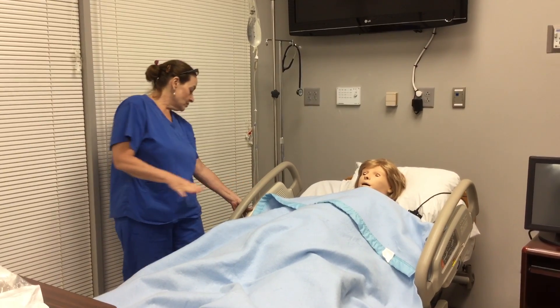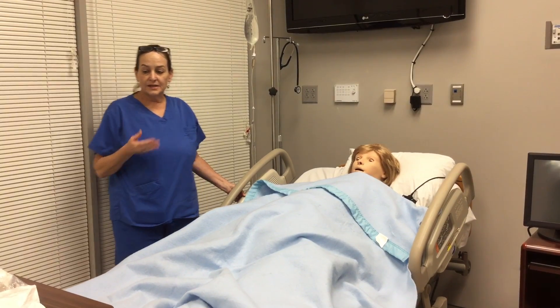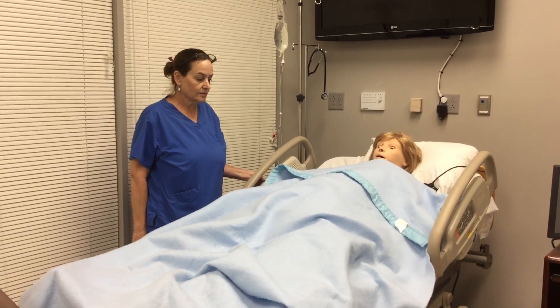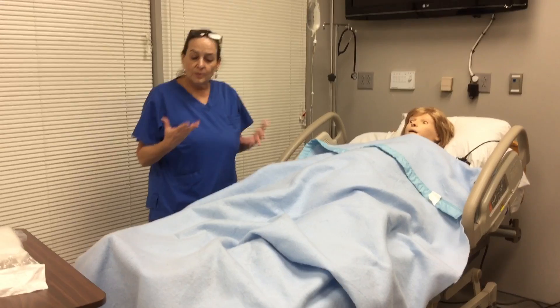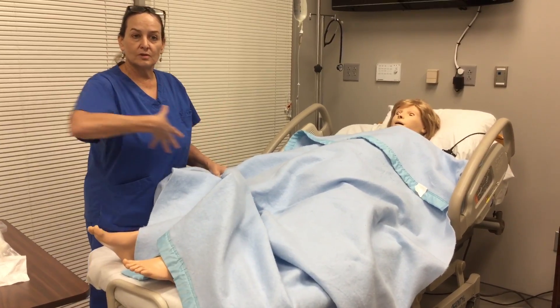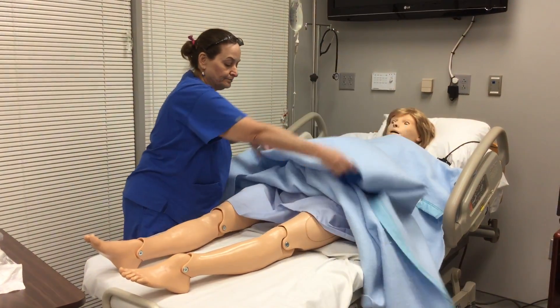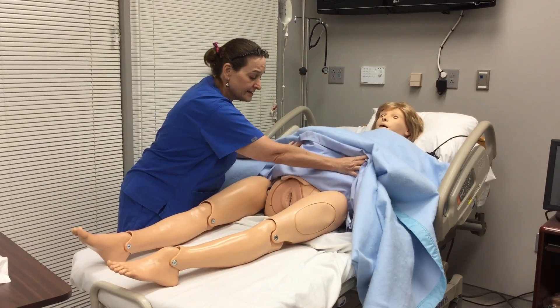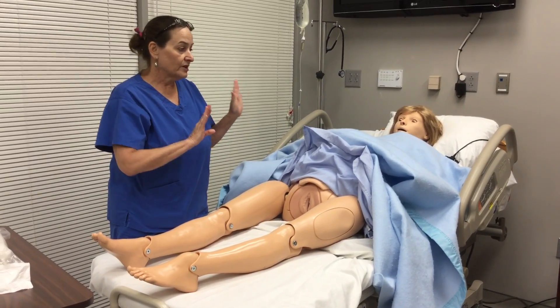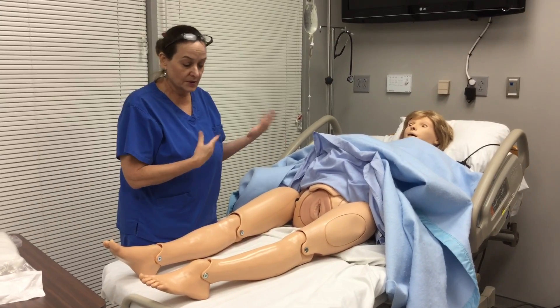You want to raise the bed and bring the patient to you so that you're not bending over the patient. When you approach the patient, once you've explained, bring the blanket or sheet up from the bottom so she remains covered up top and she will feel less exposed that way. I always ask if they want us to ask anybody to leave the room. If they're okay with them being in the room, that's fine — it's up to her — but I do explain that she will be exposed.